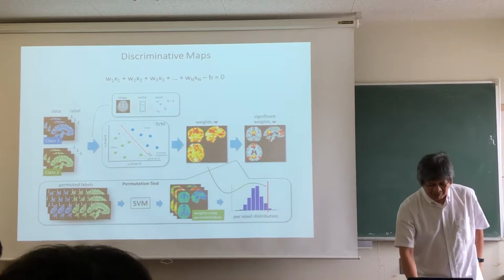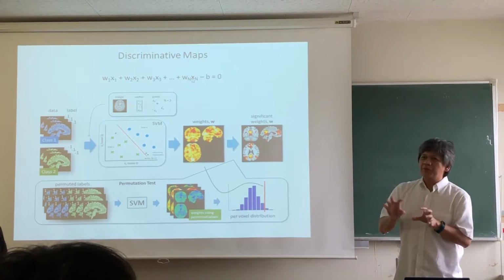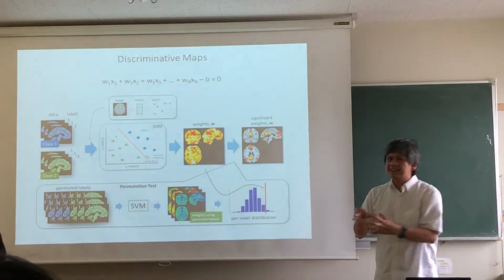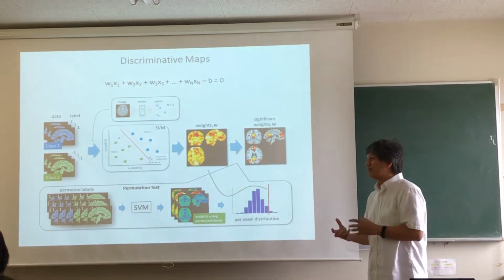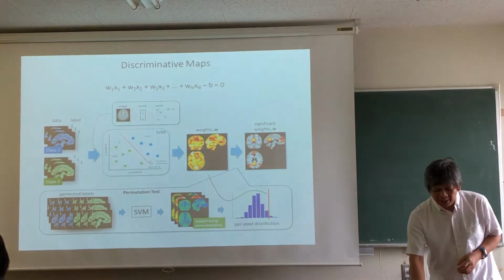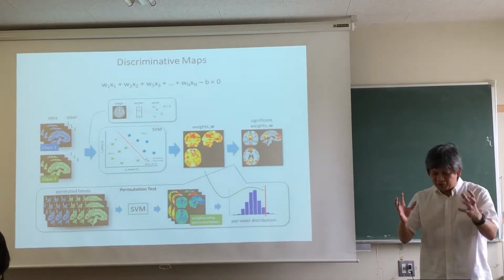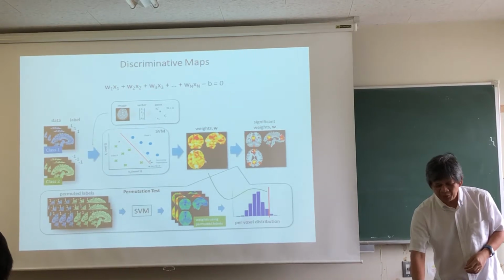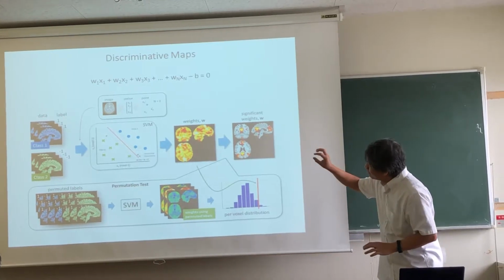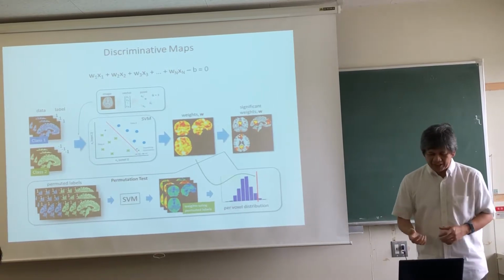And then we have W as the weights, and therefore we can look into the weights and try to find out which of these weights have contributed significantly to the classification. So for example, once we identify the separating hyperplane, then we can put the weights back into image form like this, and then we want to find out which weight is contributing significantly to the classification process.